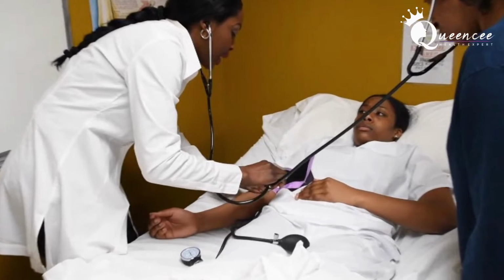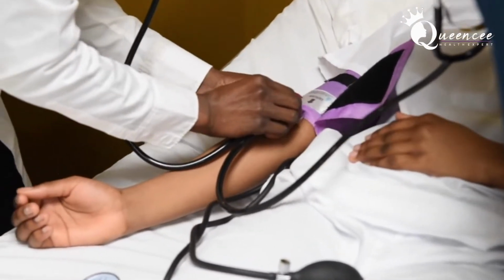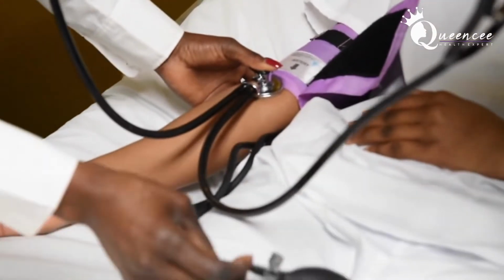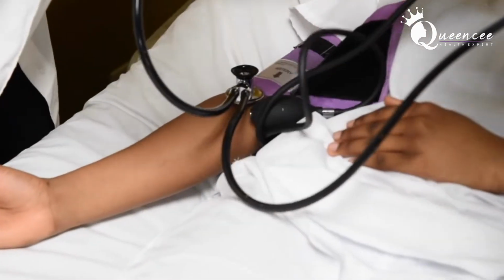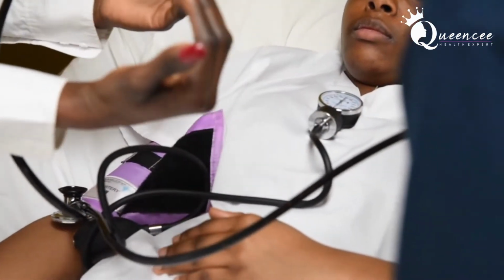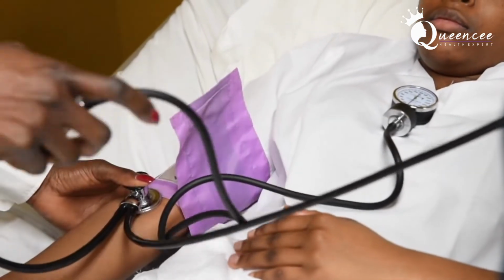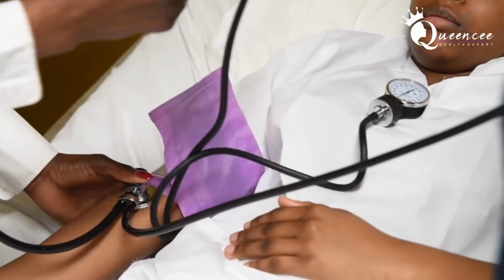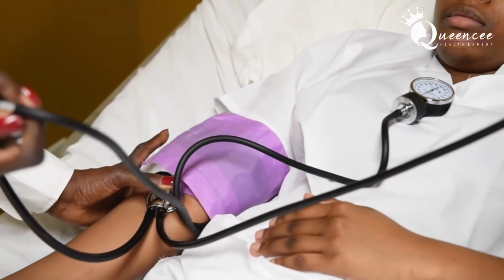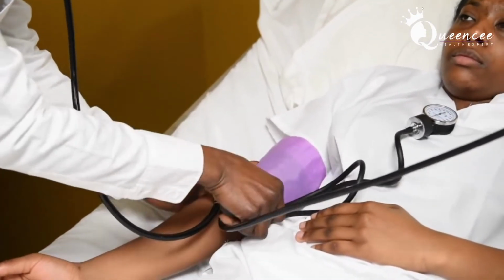You place your hand at the brachial artery. Can you come down there, please? Okay. And you place this part on your client's chest so you and the examiner can see, okay? So I'm the student, I'm doing everything. She's just going to watch and listen.